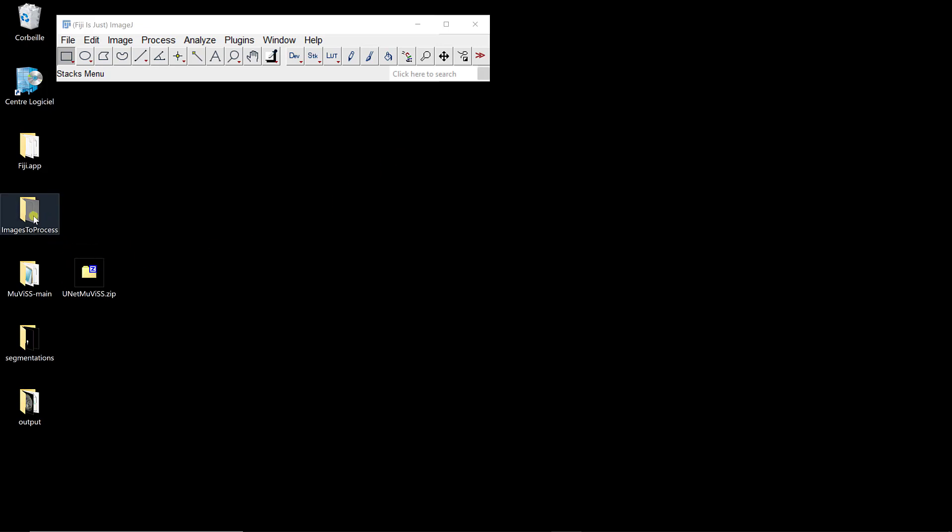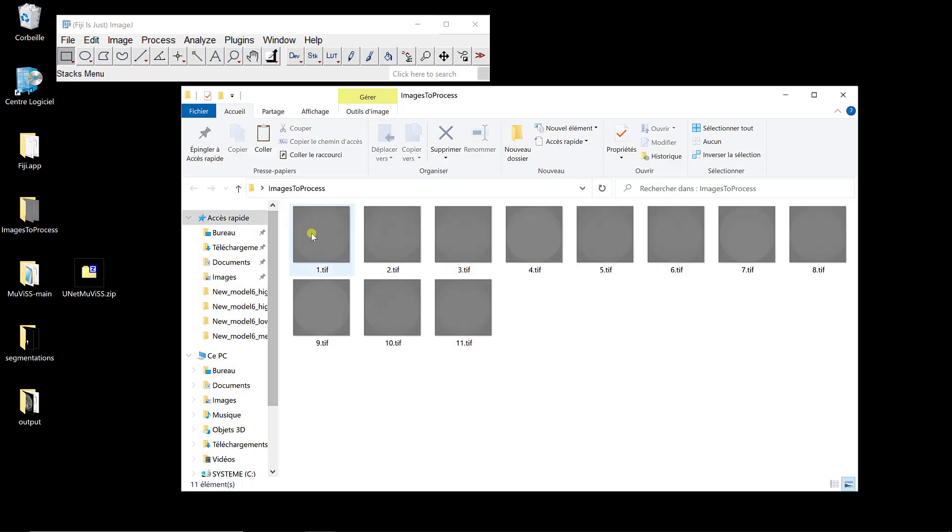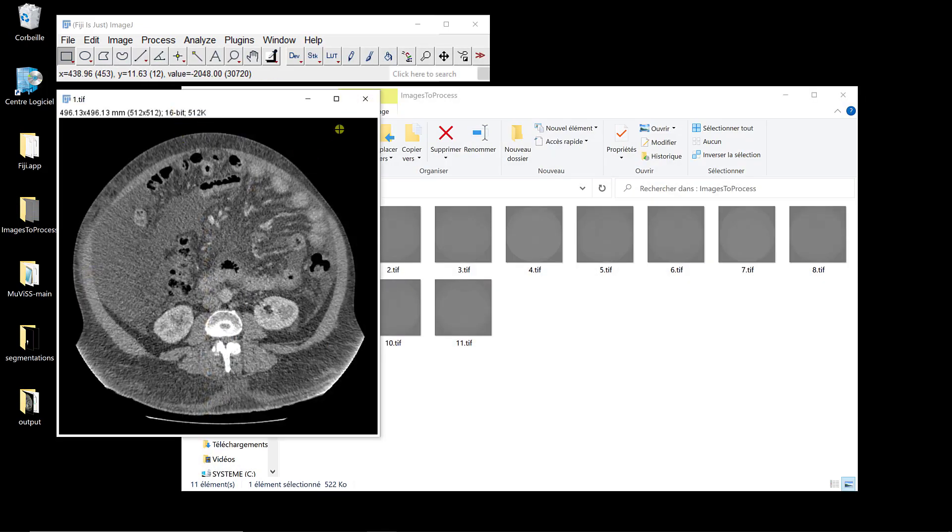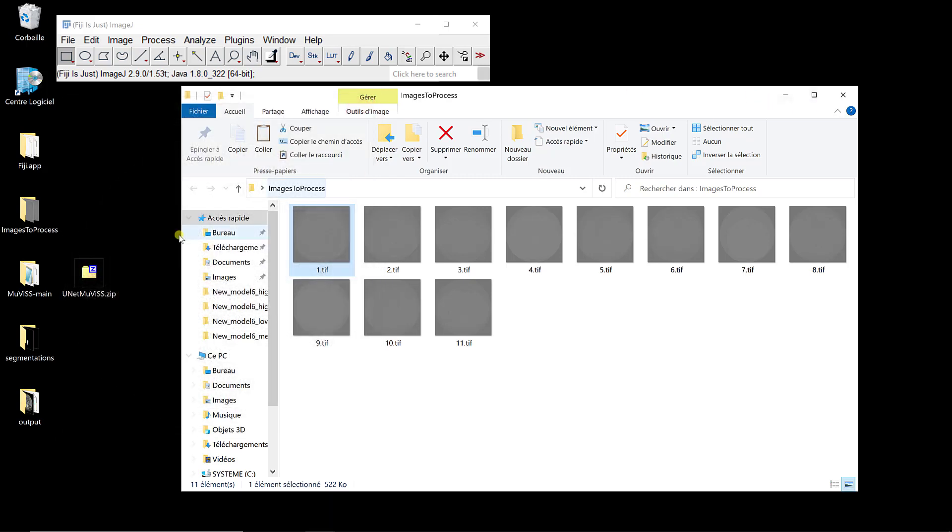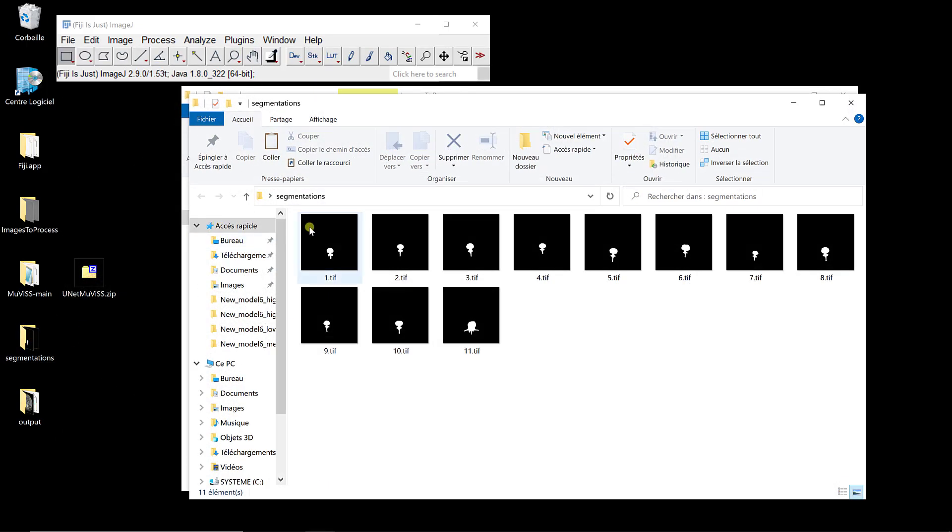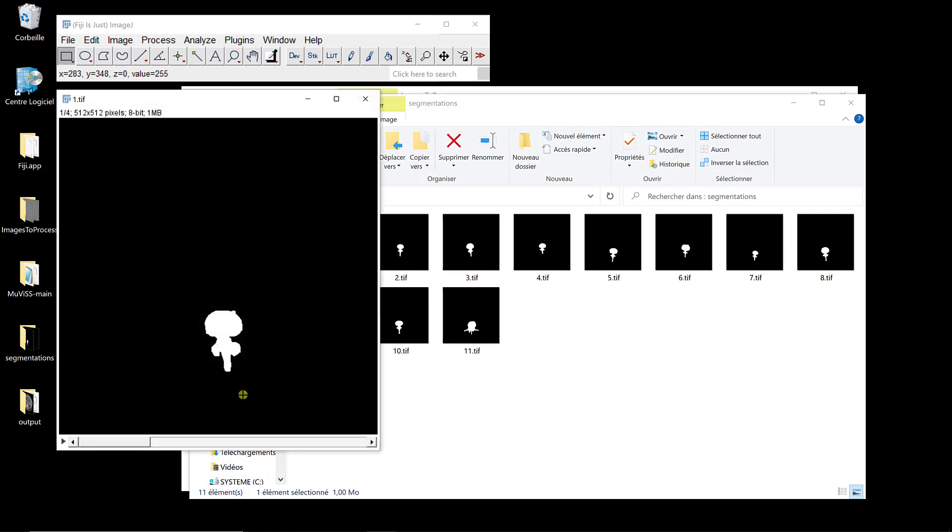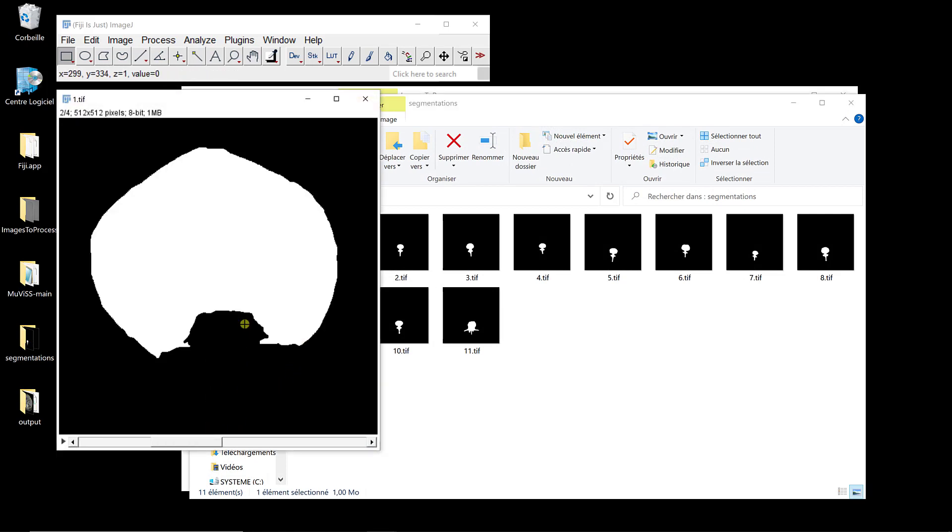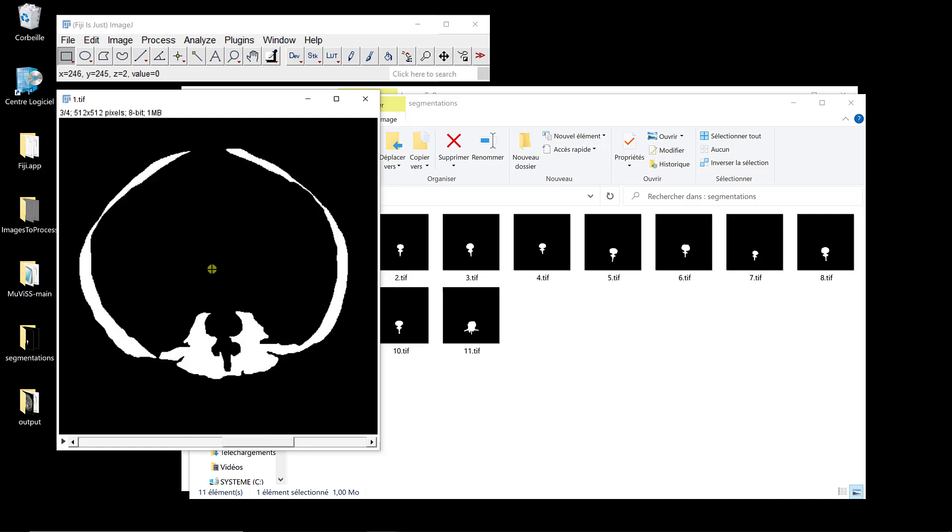So let me show you. The images to process, they're the same than before. And let's say I actually use a plugin to segment this image. So here, as you can see, we have a stack with four images. This is the backbone, this is the visceral fat, this is the muscle, this is the subcutaneous fat.